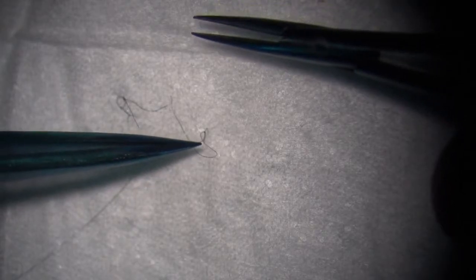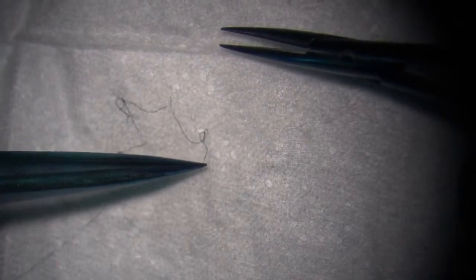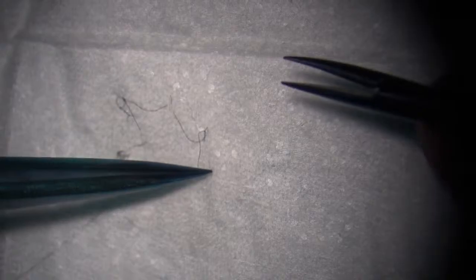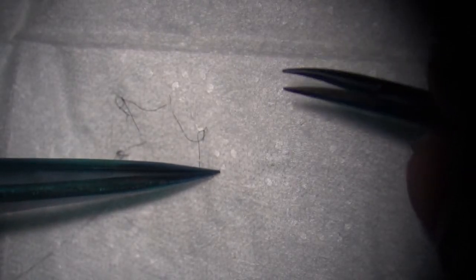The most control, like in simple microsurgery, like Dr. Chen, sometimes he really holds it just like a pen. Think about you writing your name. Your most control. Yeah, Kristof. You won't have any tremor unless you're signing a 1 million check. Yeah. Right? Then I'd be having a tremor.